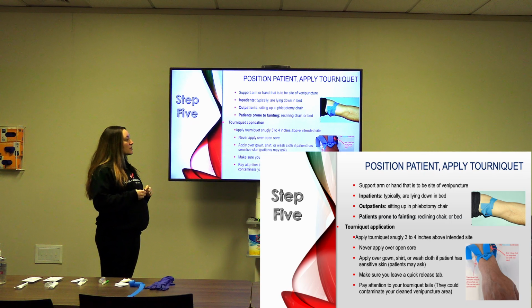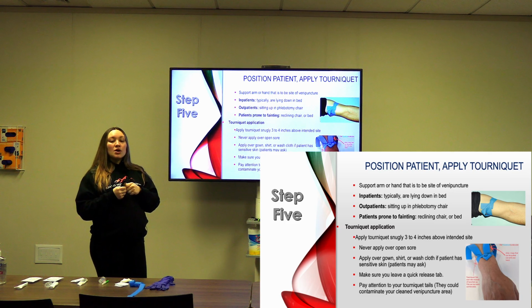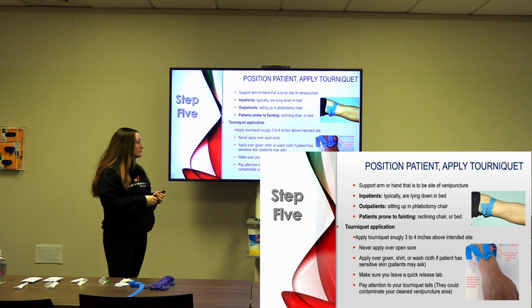Make sure you leave a quick release tab. So we'll practice this during skills week, but we'll practice tying tourniquets with a quick release tab so you can just pop that tourniquet right off of there.